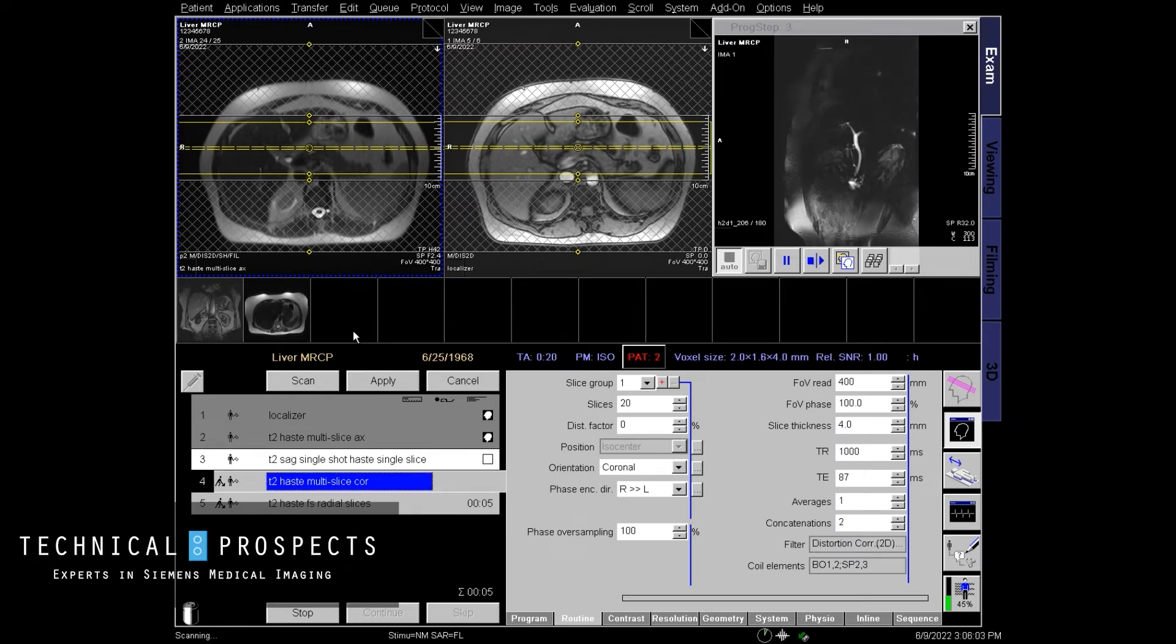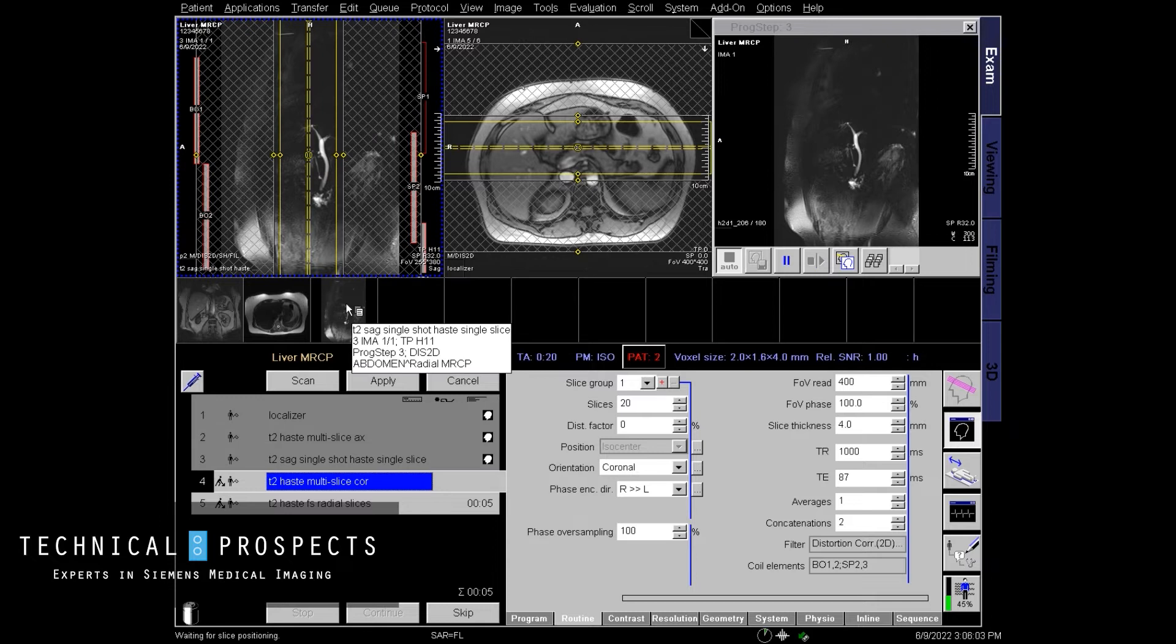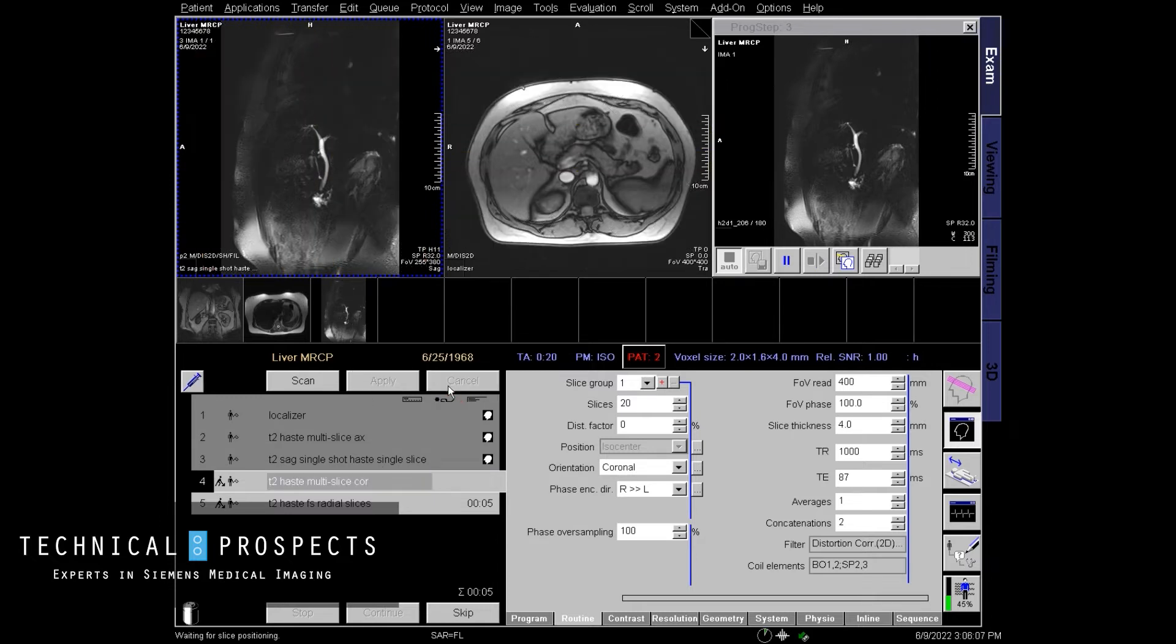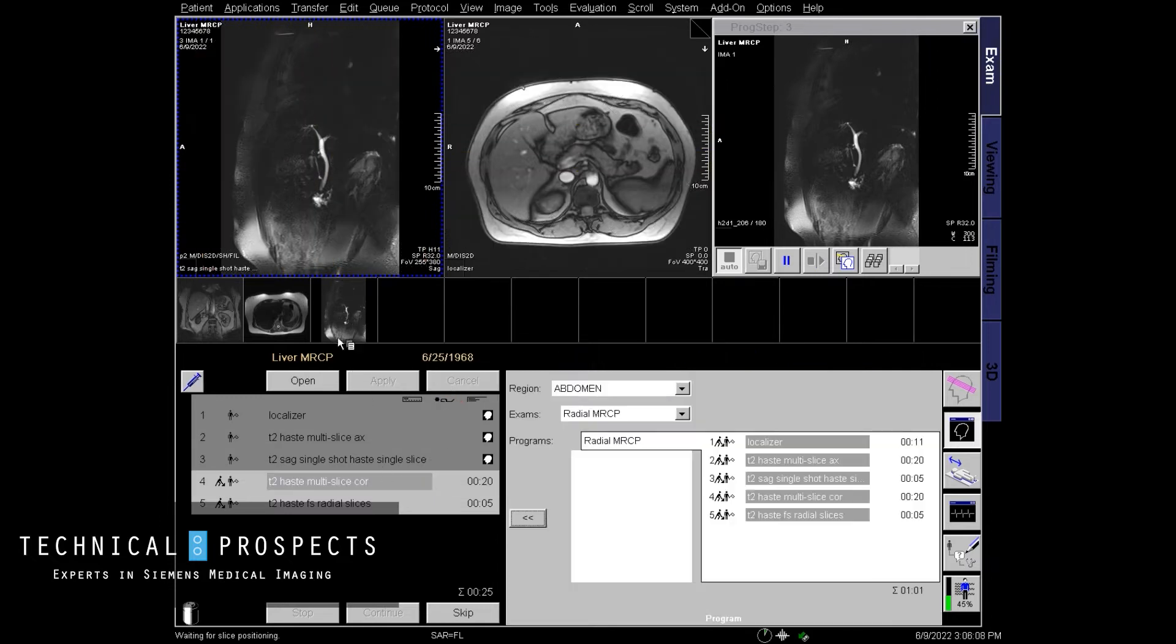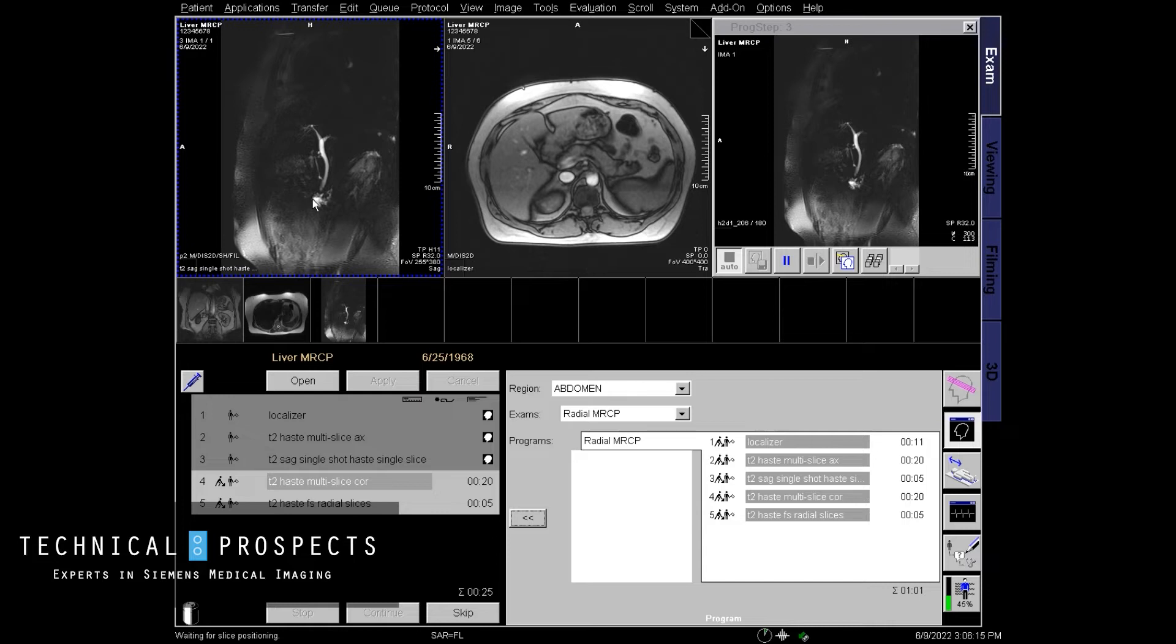And here it is. See how nicely I'm going to go ahead and close this protocol out. See how nicely the sagittal biliary tree looks. It's nice and on a sagittal view.